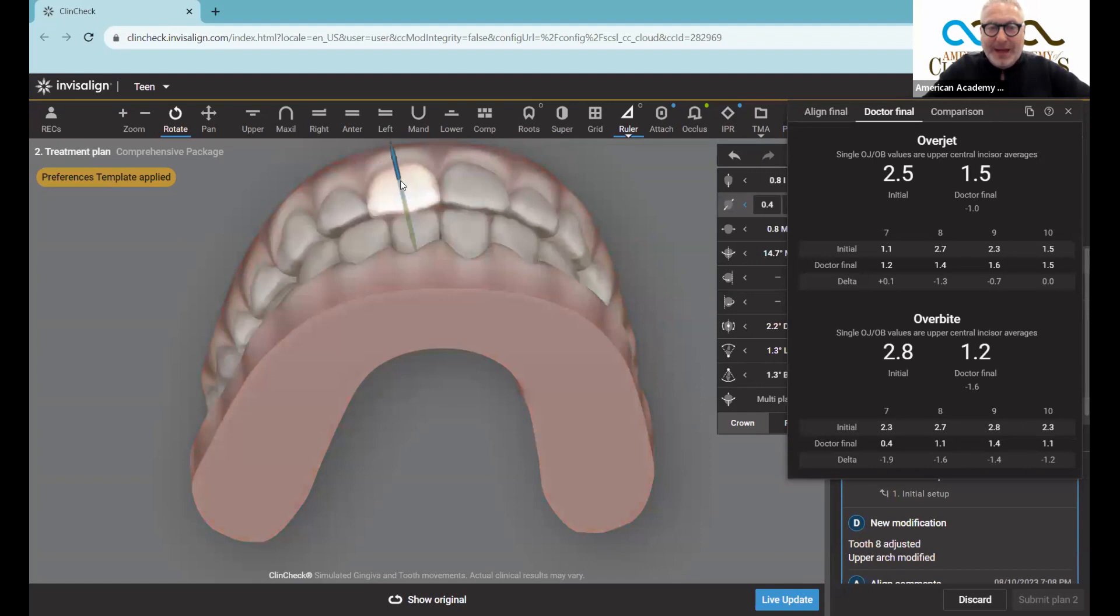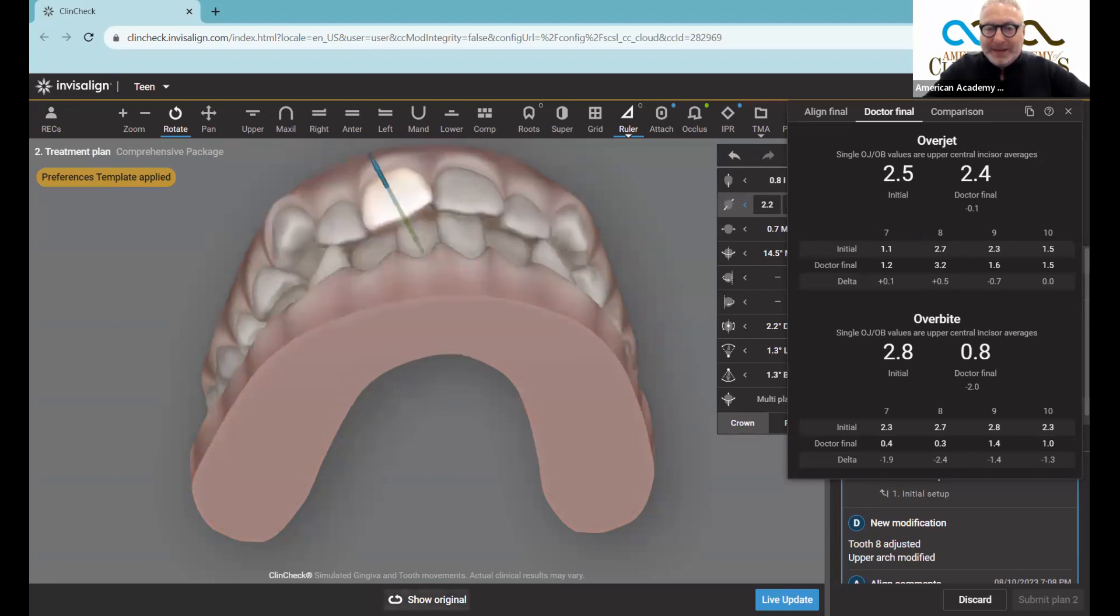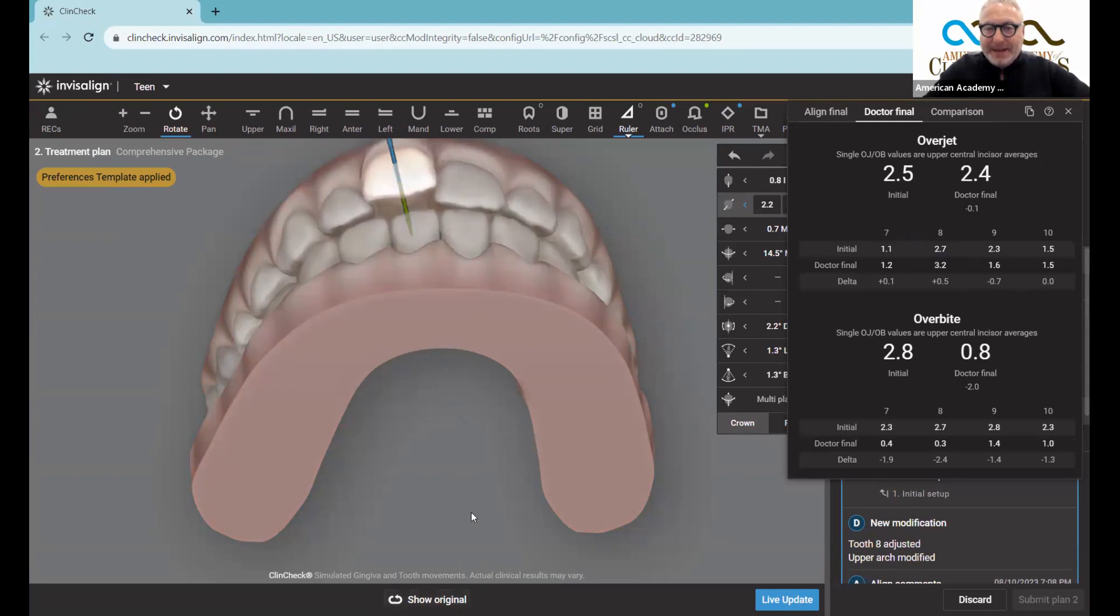Now, if I go ahead and take this tooth and I move it out to the buckle, let's watch what happens here. So I take number eight and I move it out to the buckle. Look at how this number becomes 3.2, meaning the initial overjet was 2.7. I made it even bigger.